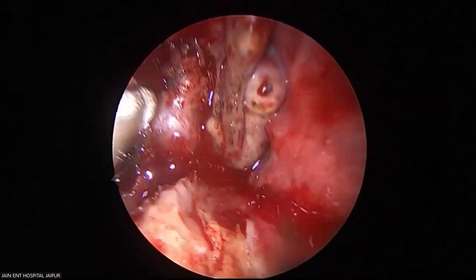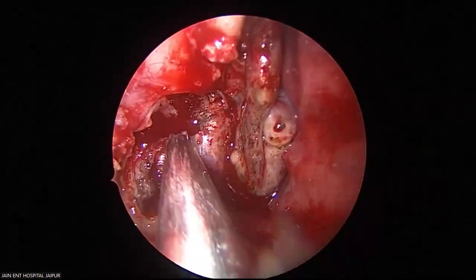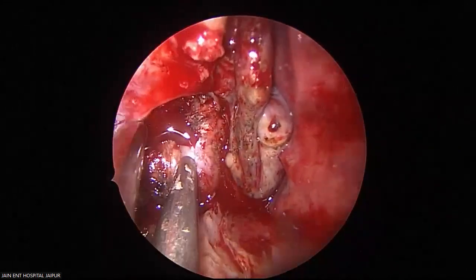Debrider. See, the focus is more and more on exposure.